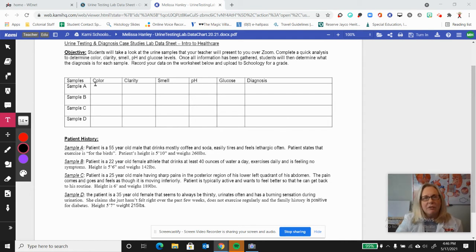Now, with all this information that we collect about each patient, you should be able to come up with a diagnosis. As patient care techs or nurses or technologists, we are actually not allowed to diagnose, but we give our recommendation to the doctor, and the doctor puts his stamp on it as the diagnosis. We're trained to look for the things that are wrong, and that's what we're going to do today. See if there's anything wrong. It's kind of like a game of Clue, where you're collecting clues about this patient and putting it all together, and process of elimination is going to lead you to what you think the diagnosis is.